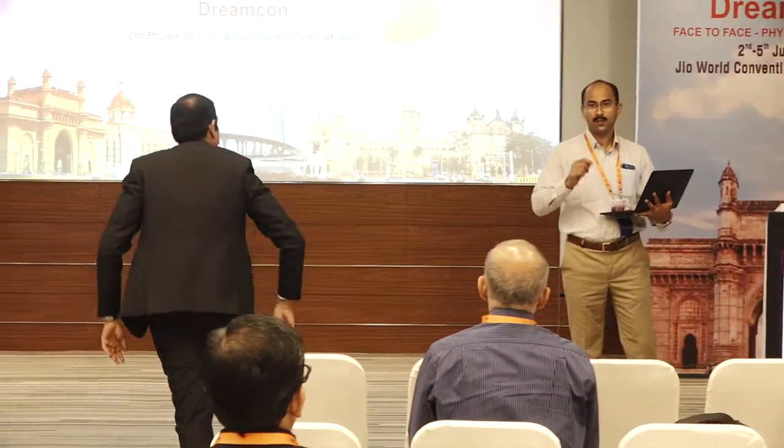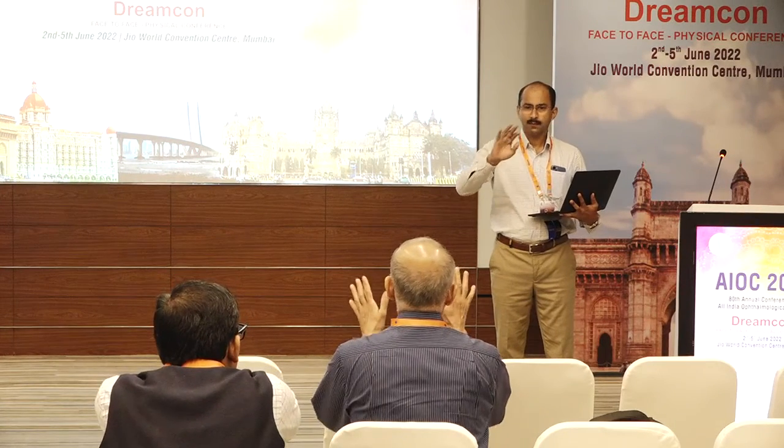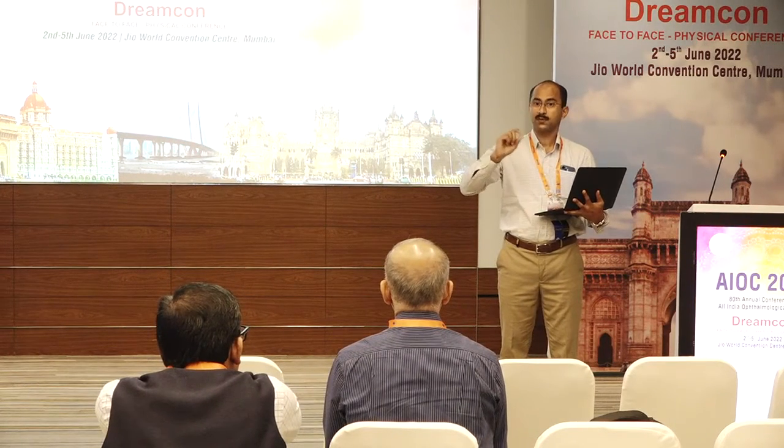Is he here? Yeah. Actually, going back to the basics. If you do a good slit lamp examination and binocular view, you can pick up the drusen. You can easily pick up, sir. The problem is, if you go according to the machine, that's what it is. No, but the consultant went by CD ratio. You can pick up the drusen is okay, but this was a mistake that was committed.